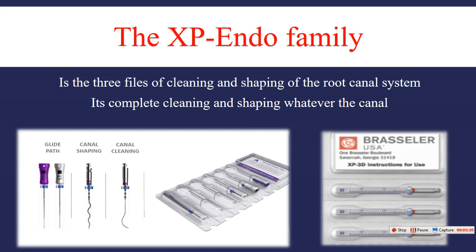This instrument is for single use, and each instrument can treat a tooth even with more than 4 canals. For single use, one for cleaning and one for shaping. Before using these, we should use the glide path.